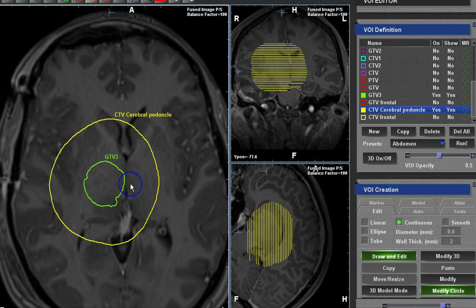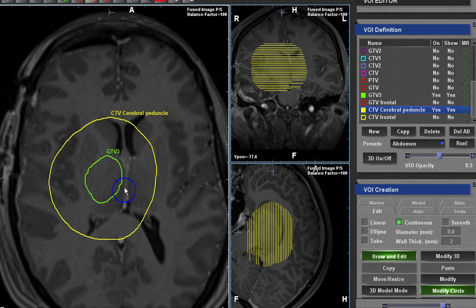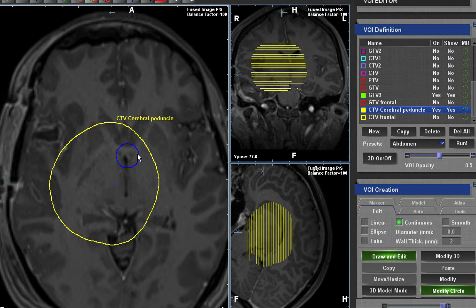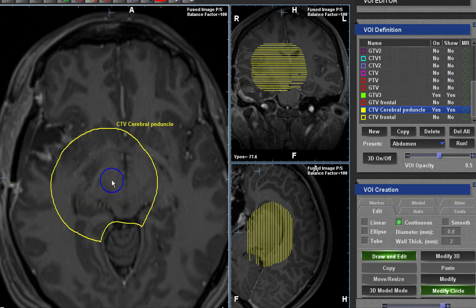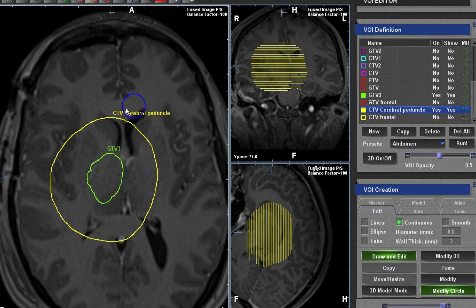At the third ventricle, there is the anterior commissure and the posterior commissure — communicating fibers between the two cerebral hemispheres. Please do not trim your CTV at the third ventricle. Leave it, because the tumor may be crossing along the anterior or posterior commissure. Any communicating fibers between the two hemispheres should not be trimmed.